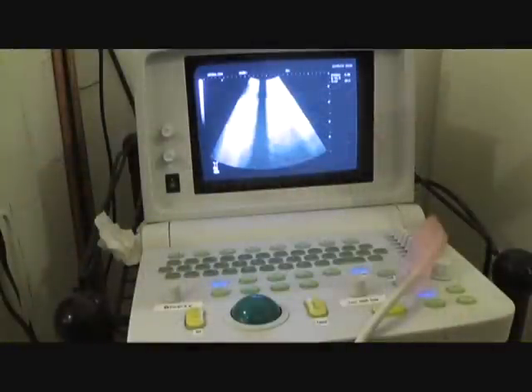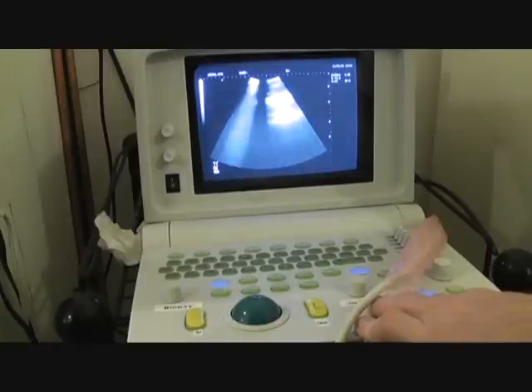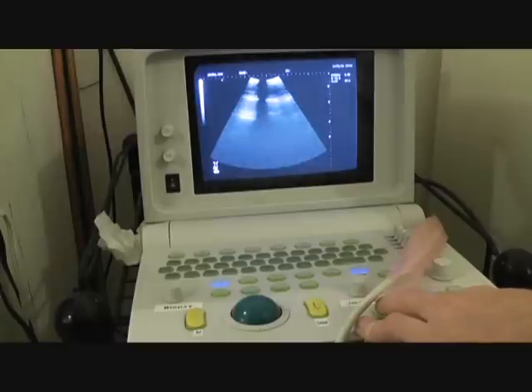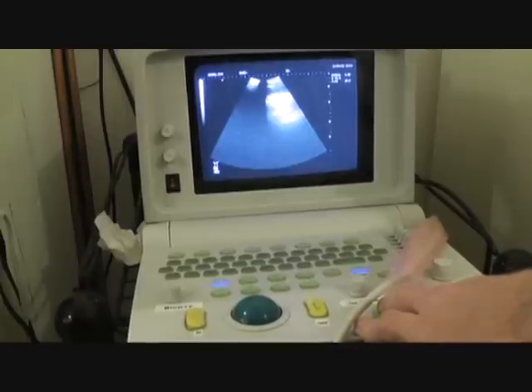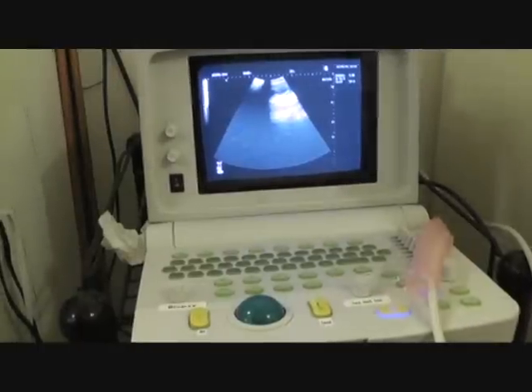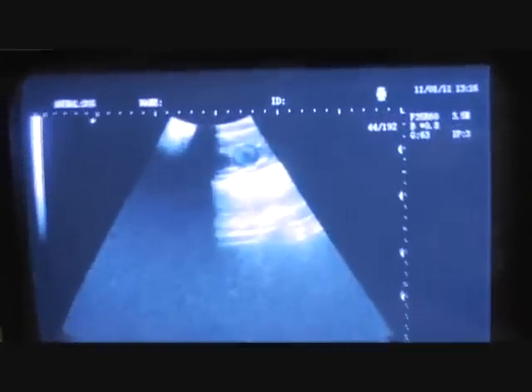Here are the follicles actually on the ultrasound, so you guys can see what we're looking for when we're probing the females. We'll try to get a good picture here — we'll have to zoom in once we find them. We found them here, so Justin just has to press freeze on the ultrasound. Now we'll zoom in so you can see. You can see that that's a follicle right there.